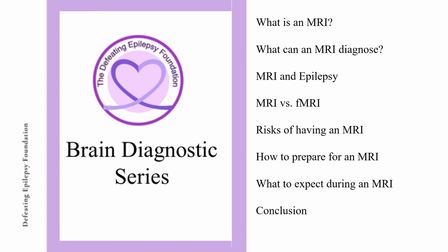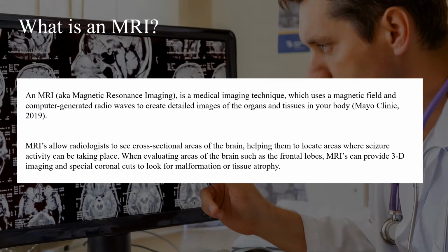We appreciate your support. An MRI, also known as magnetic resonance imaging, is a medical imaging technique which uses a magnetic field and computer-generated radio waves to create detailed images of the organs and tissues in your body.